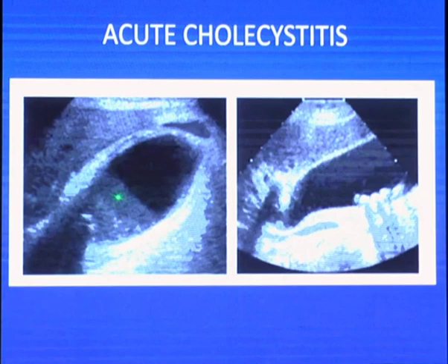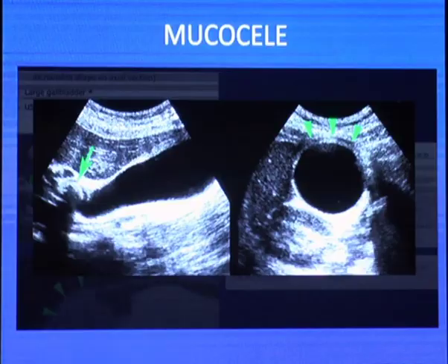This patient shows distension of gallbladder, calculi, and when we trace, there is a stone in the cystic duct. This is the neck region and here is the cystic duct region. So this cystic duct stone is impacted and the patient has acute cholecystitis.